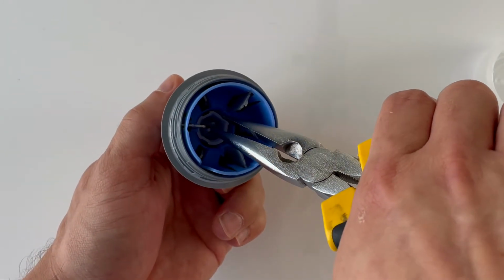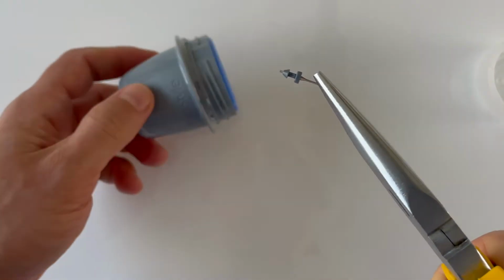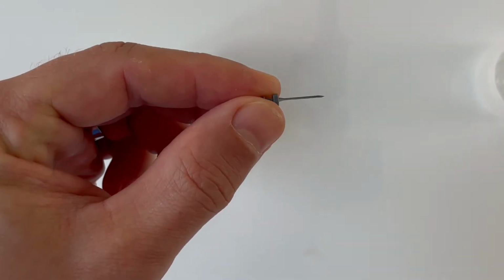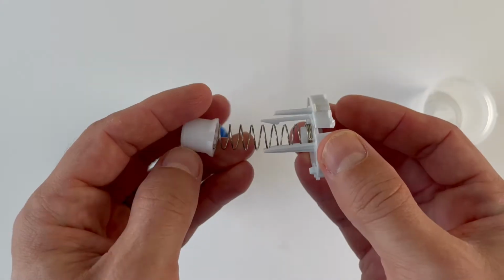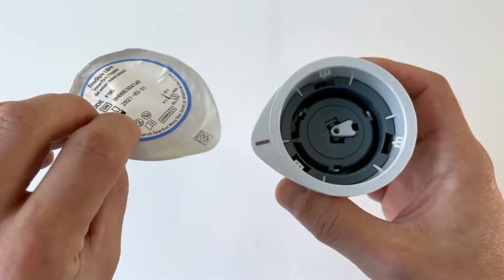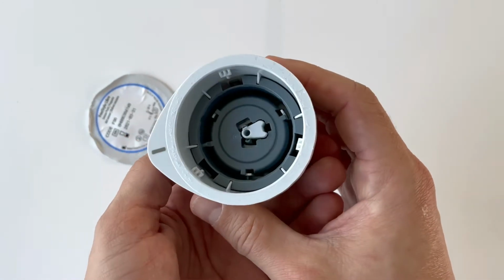So just be careful when you're doing this so that you don't get hit by the metal spring or the needle. Next, you can pull out the needle, and it's the only needle in the package. You should always dispose the needle in a sharps container so that nobody gets injured. And then you can remove another white piece of plastic, and this will give you a better idea how the applicator mechanism actually works.